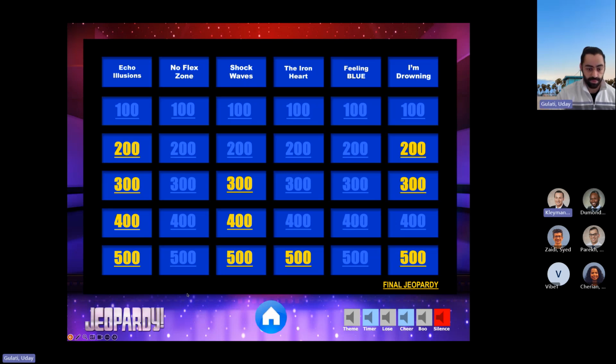Solid job, guys. So with any patient from now on in the ICU, anybody with even some reduced regional wall motion or concentric LVH, anybody with reduced EF, who may have some sort of diastolic dysfunction, just put your continuous wave through there and look at the E to A. If they have a grade 2 or grade 3, and you're diuresing them anyway, do a reassessment, and you will see the changes.